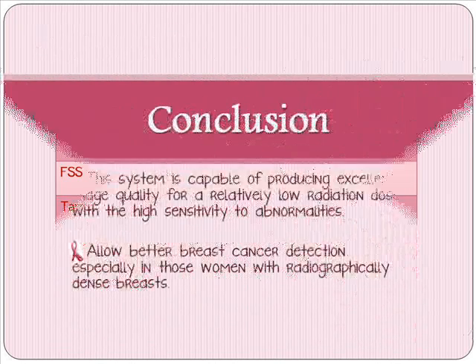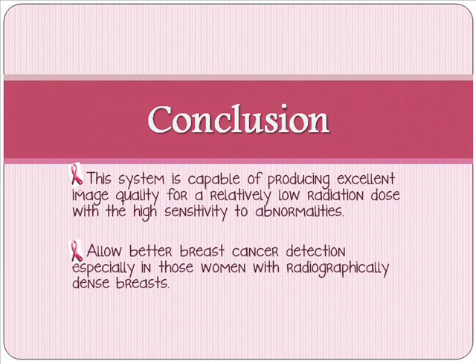So, as a conclusion, this digital mammography system is capable of producing excellent image quality for a relatively low radiation dose with a high sensitivity to abnormalities. Thus, this will allow better breast cancer detection, especially in those women with radiographically dense breasts.